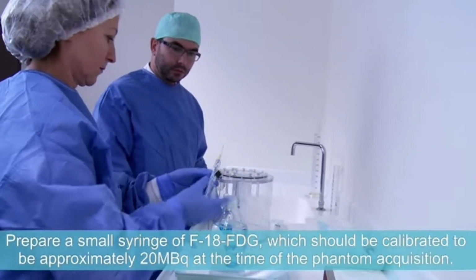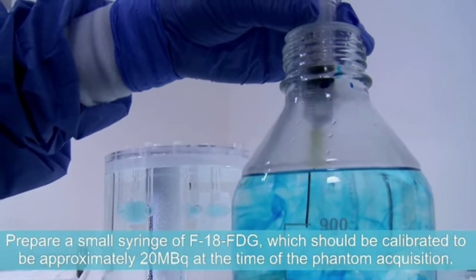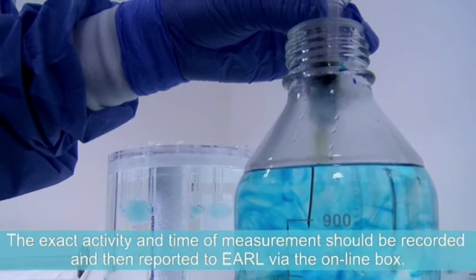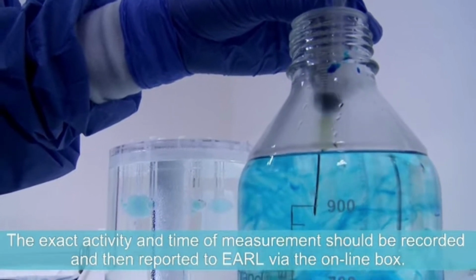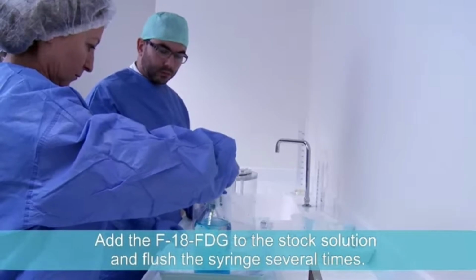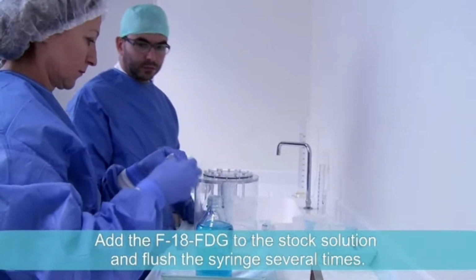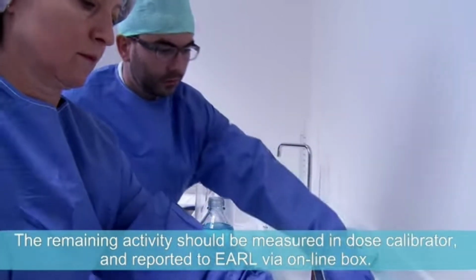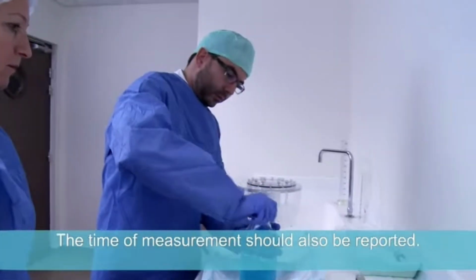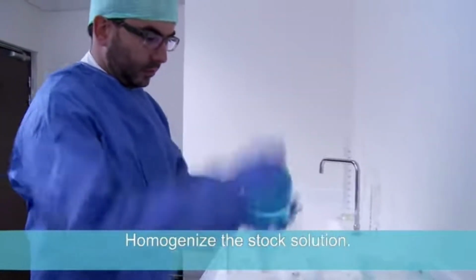Prepare a small syringe of F18 FDG, which should be calibrated to be approximately 20 megabecquerels at the time of the phantom acquisition. The exact activity and time of measurement should be recorded and then reported to EARL via the online box. Add the F18 FDG to the stock solution and flush the syringe several times. The remaining activity should be measured in the dose calibrator and reported to EARL via the online box. The time of measurement should also be reported. Homogenize the stock solution.